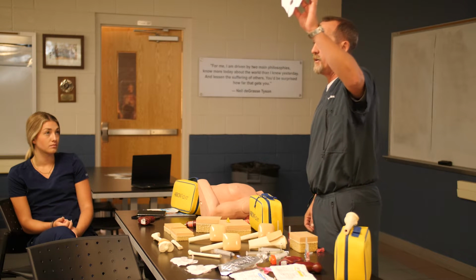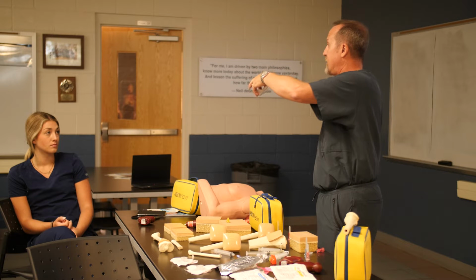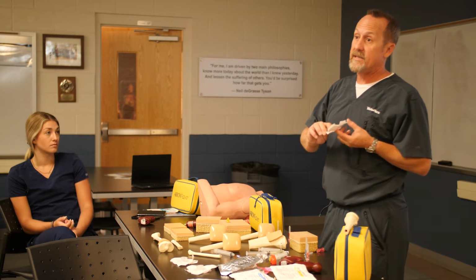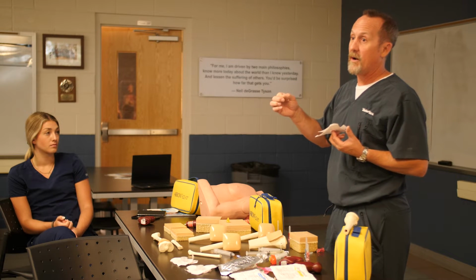The next thing you guys are gonna do is get your stabilizer dressing, okay? These are I think your guys' kits, you have these separately. These are really important to use. They stabilize the dressing, they protect it, they keep that needle from getting dislodged or bent or broken off, okay?